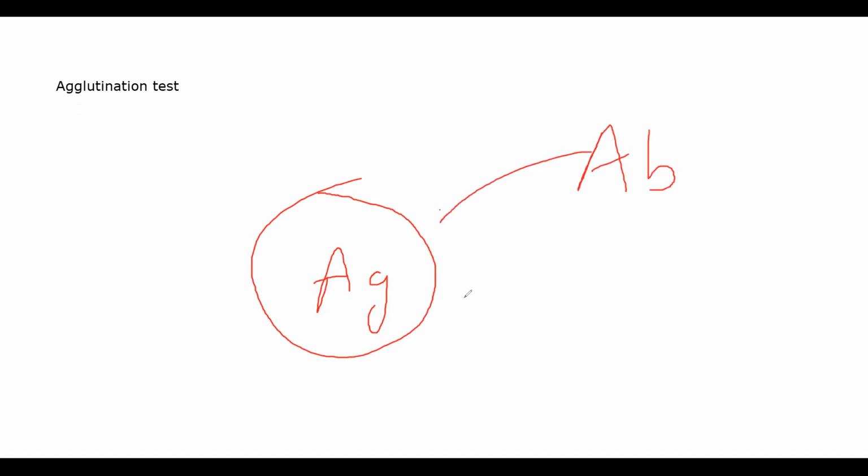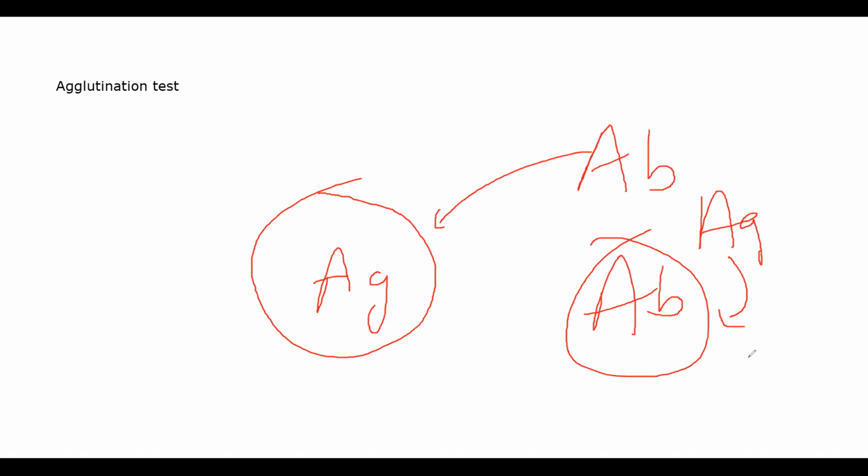ठीक है? Sometimes what will happen is soluble antigen or soluble antibody is made insoluble by coating it with latex, and with some particular desired antigen you will coat it, एंटीजन और एंटीबॉडी. अगर इनिशियली एंटीबॉडीज को कोट करें आप लेटेक्स से, या अगर एंटीजन को कोट करें लेटेक्स से, then let's suppose antigen is coated with latex, you will add an antibody. ठीक है? अगर एंटीबॉडी को कोट करें लेटेक्स से, एंटीजन ऐड कर दे. ठीक है? What ends up happening is, if it is that specific type of antigen or antibody, मतलब ये एंटीजन को स्पेसिफिक एंटीबॉडी है बोले तो क्लंपिंग होती. अगर नॉन स्पेसिफिक है बोले तो there will be no clumping, they will not attach to each other.